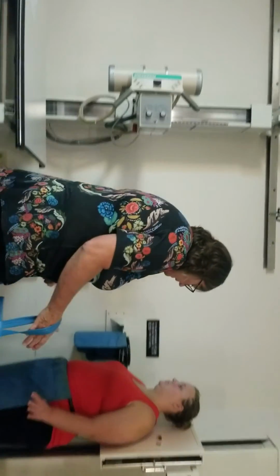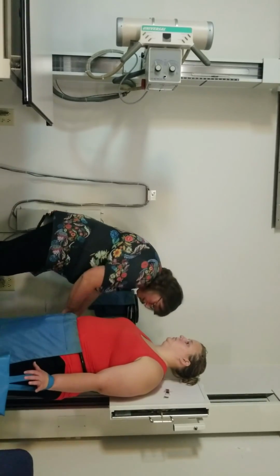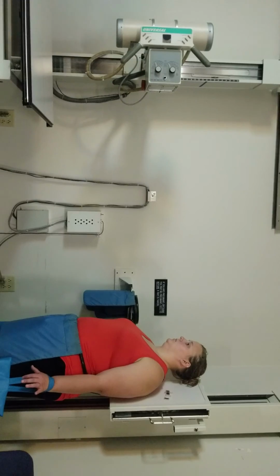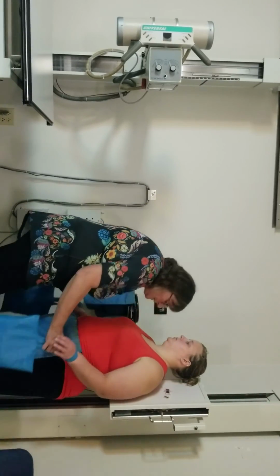I got everything set up. I'm going to put the weights around your wrist here. We're going to put some weight on. Just hold still, hold your breath, don't move. Good. I'm going to come take the weights away right away. And that's it.